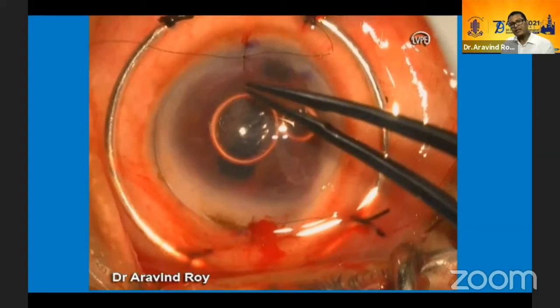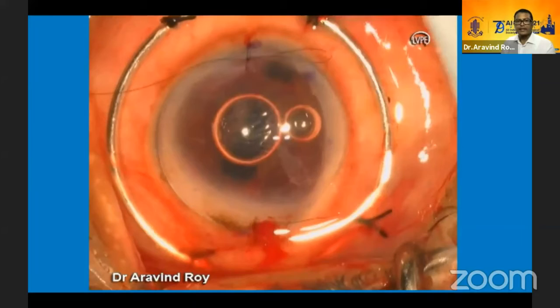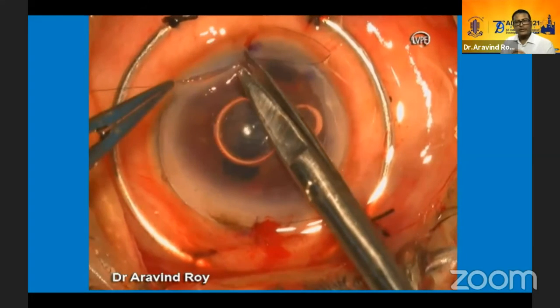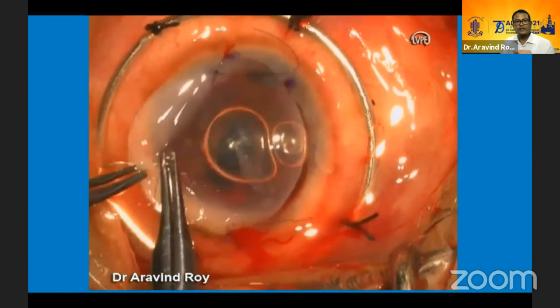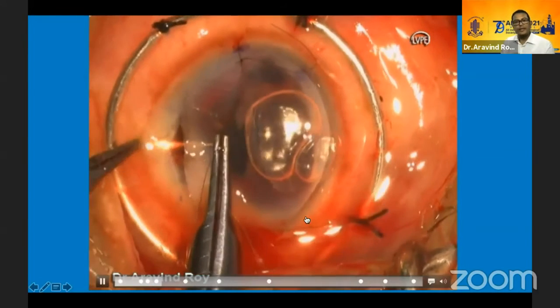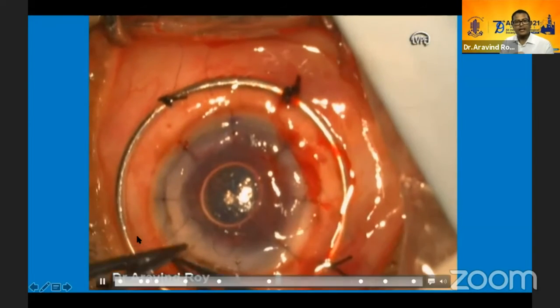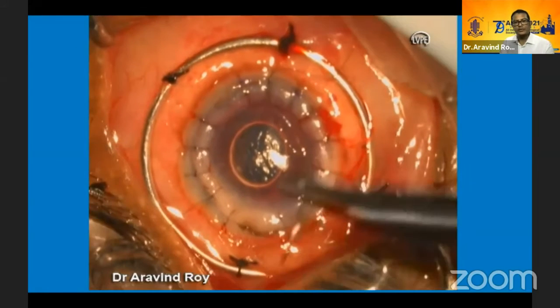As you can see at the beginning of the surgery, glycerol corneal tissues tend to be fairly clear and it allows somewhat good visualization of the anterior segment. However, the tissue tends to swell up during the surgery and it becomes opaque, and suturing also is a bit difficult because these tissues are stiff and may not be very pliable. A Flieringa ring was used because it was a large corneal perforation, and the procedure was completed with 16 interrupted sutures.